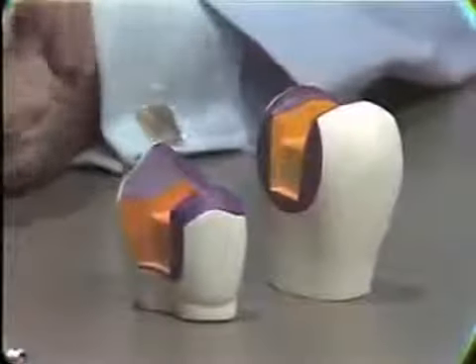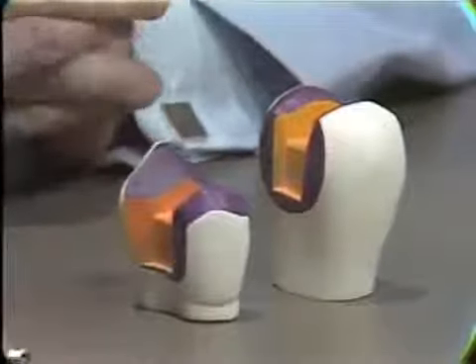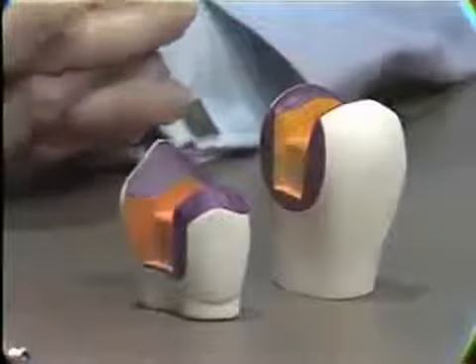The MOD inlay, then, a useful type of bridge retainer in cases where previous restorations are present in teeth. Can be used, of course, on bicuspids, as shown here, or also on molar teeth, either in the maxilla or in the mandible.